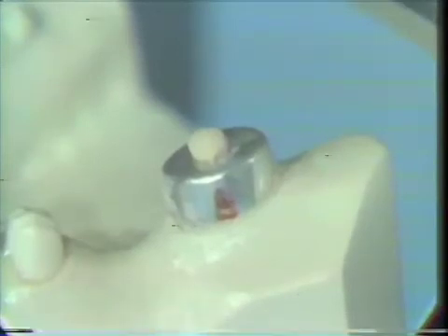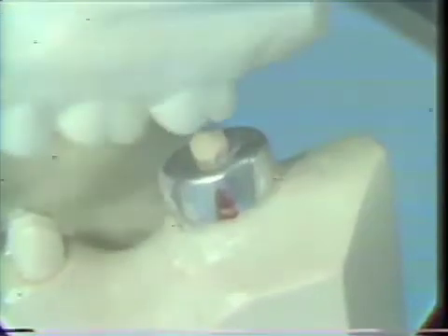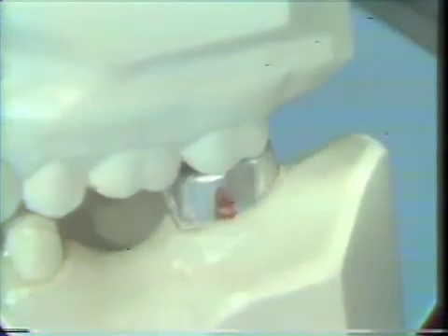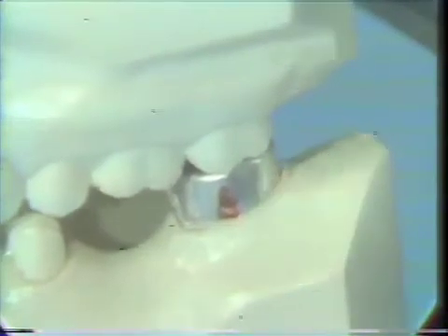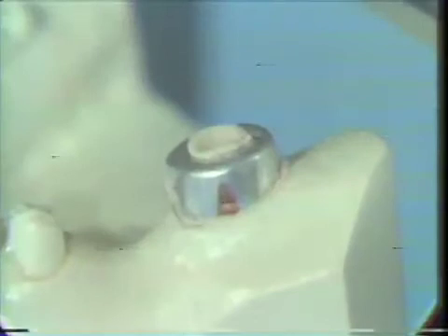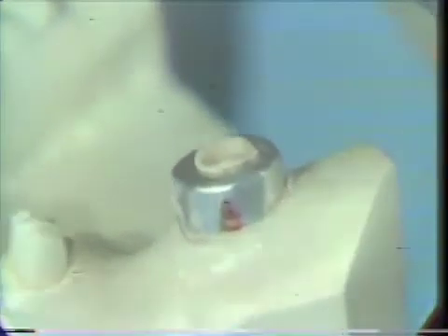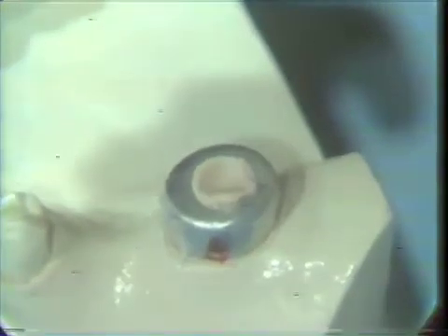And when it attains its proper consistency, we will instruct the patient to close into centric occlusion in this particular instance and register an opposing cusp in the material. And here you can see that we have registered an opposing cusp in the material, and this is more than adequate amount of articulation with the opposing cast to allow us to get a very stable interocclusal relationship.